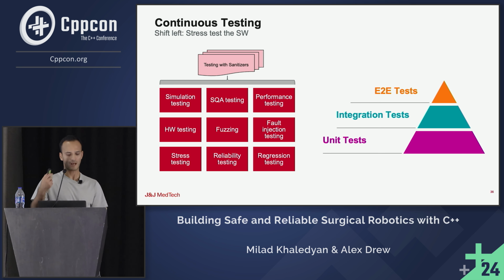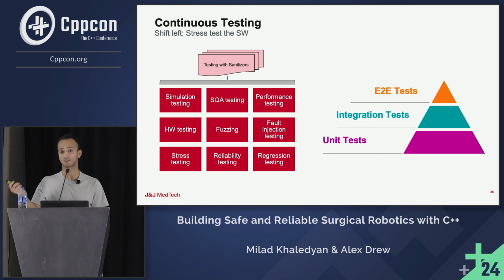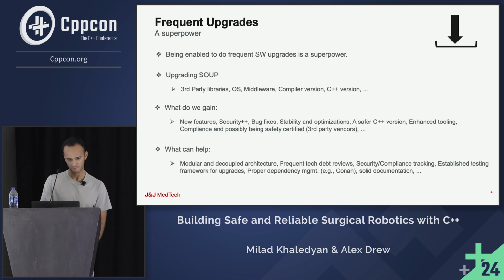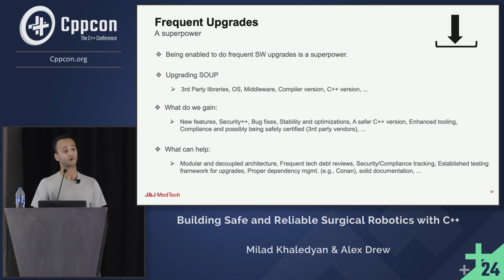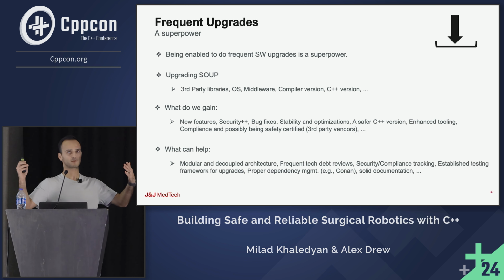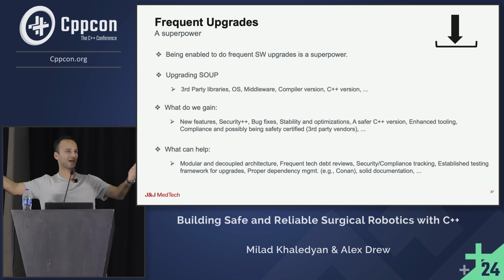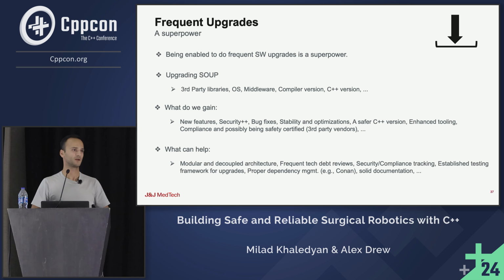So we have reliability testing, stress testing, simulation testing, SQA testing, performance testing, which is extremely important. So I think this is one of the last slides that I have for this piece, which is frequent upgrades. So medical device, when you start development, it takes probably, maybe 7 to 10 years for a very complex system, right? So you start from 7 years ago, you use, maybe Boost 1.53 or something like that, right?